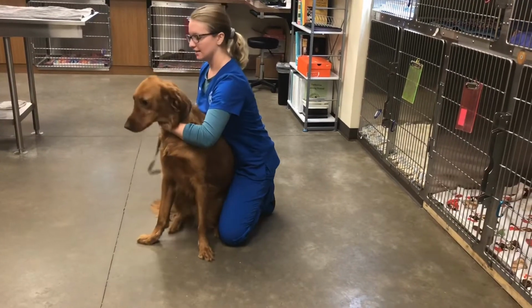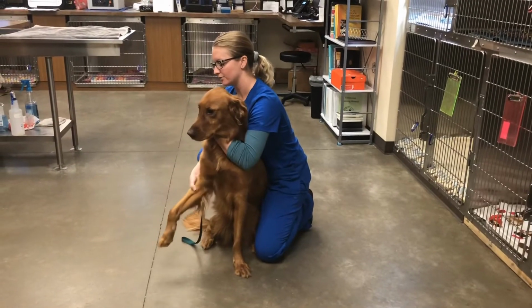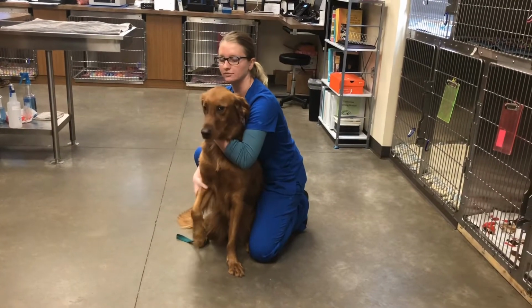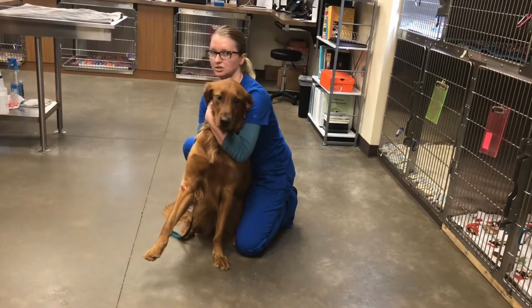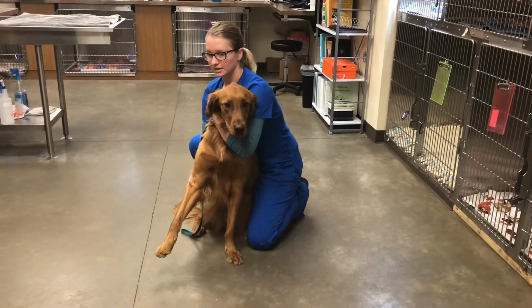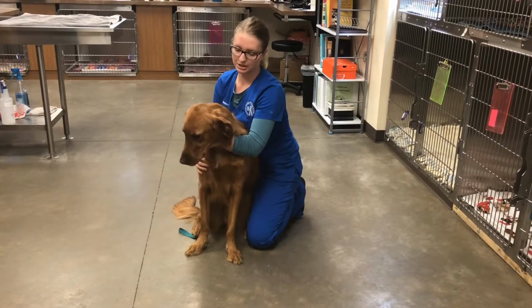It's okay. And then I will extend his limb forward, supporting the elbow. His cephalic vein runs along the dorsal aspect of his front limb here. And I'll occlude the vein by gently rolling and applying pressure with my thumb so that they can draw blood this way.